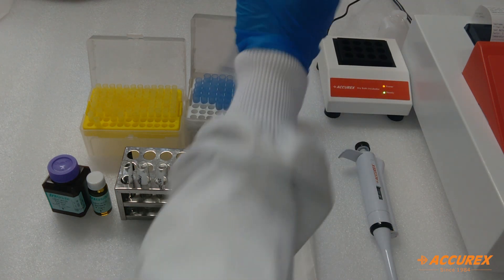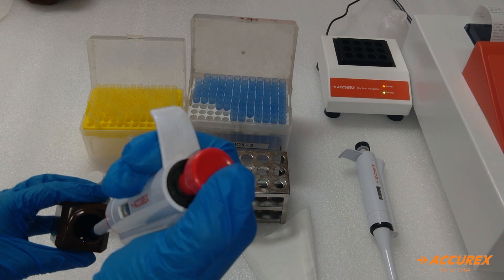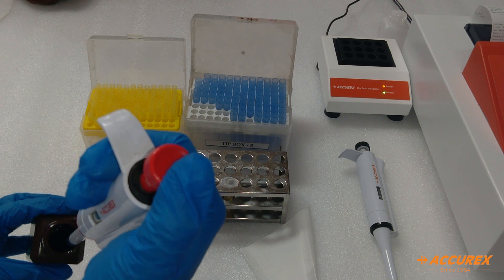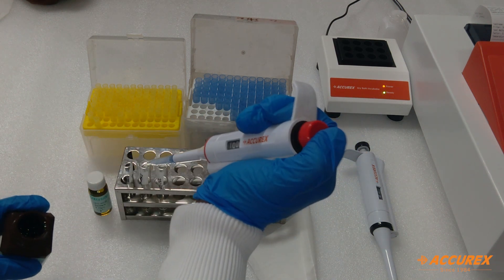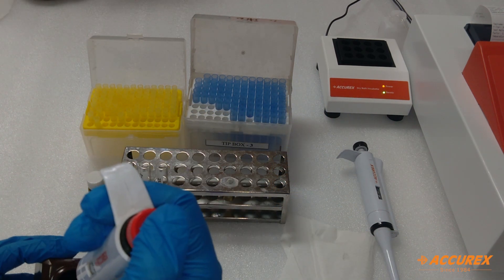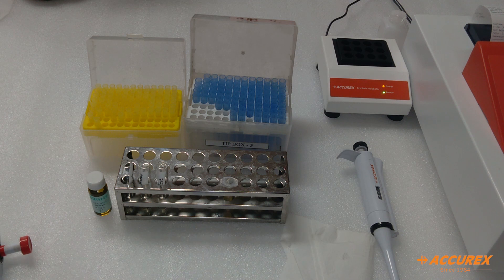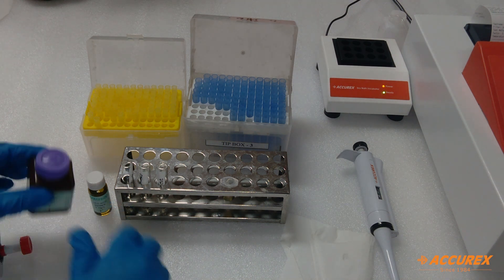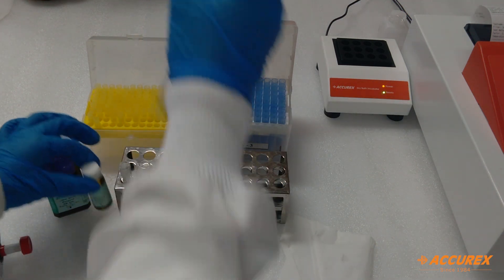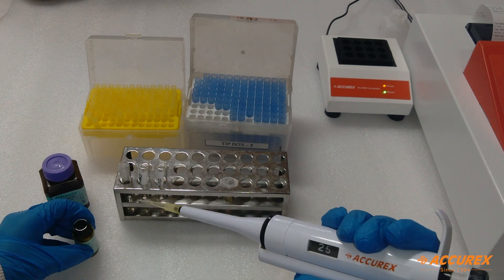Now we will proceed to the testing procedure. Take one ml reagent in all three test tubes — the first one is blank. The second one is standard: take 25 microlitre standard, wipe with the tissue paper, and mix with the reagent properly.